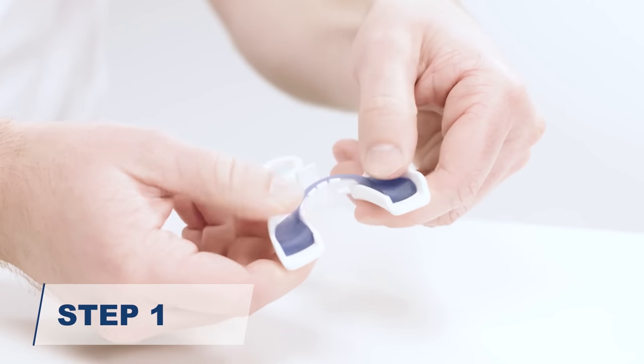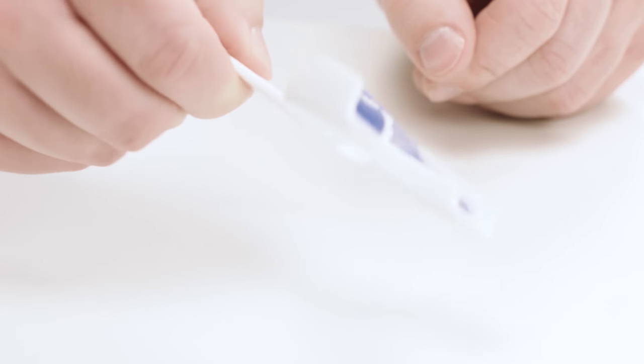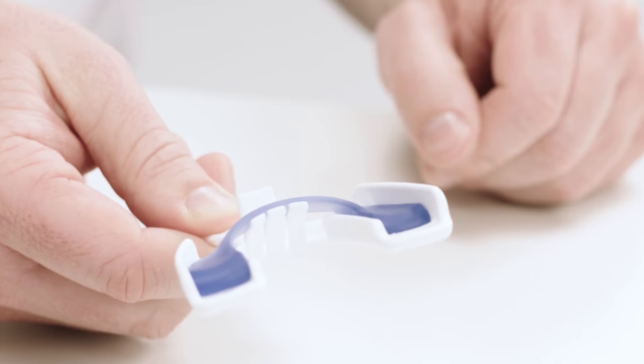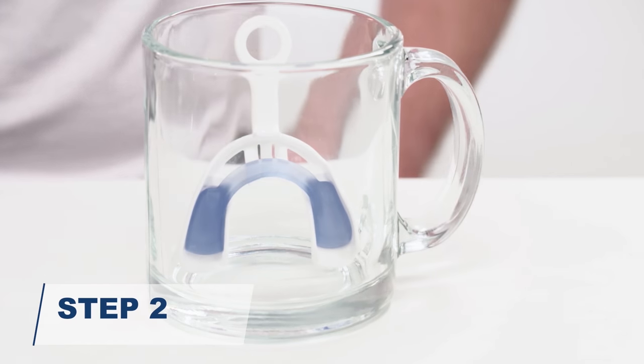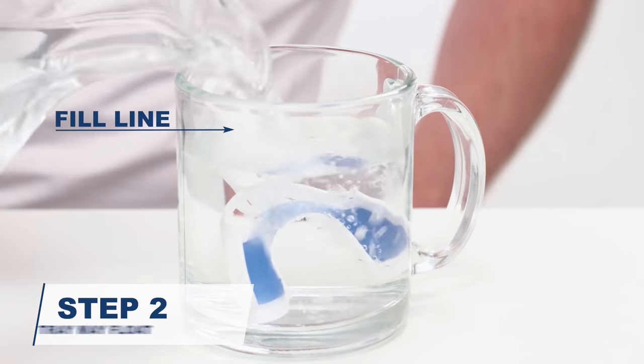Press down the bite pads to ensure the blue guard is securely attached to the white forming tray. The guard must remain attached to the tray until the final step. Place the forming tray with the guard into your cup, and fill the cup with water up to the fill line on the tray handle.